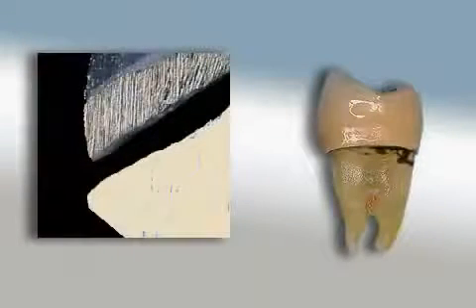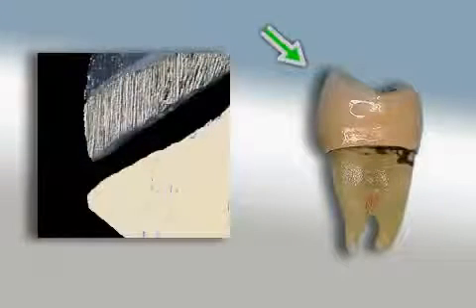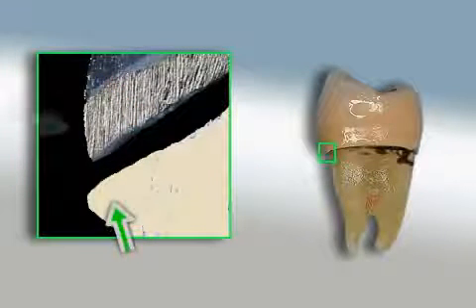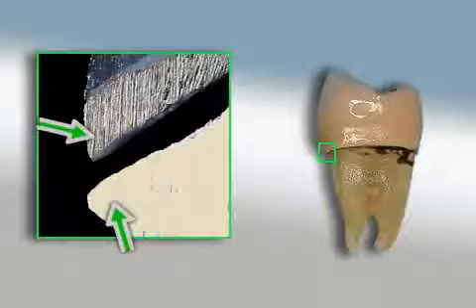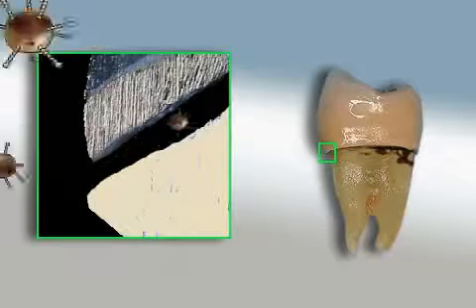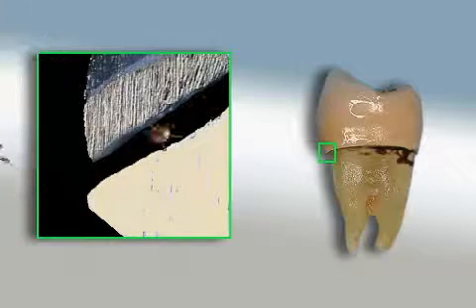Here you can see a ruptured tooth with a crown. The dark spot on the edge of the crown is caries. With the help of strong magnification, you can clearly see the gap between the tooth, here in beige, and the edge of the crown, in metallic blue. The crown was not an exact fit, and bacteria were able to invade, leading to the formation of caries.